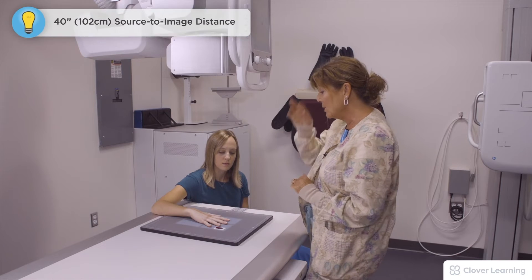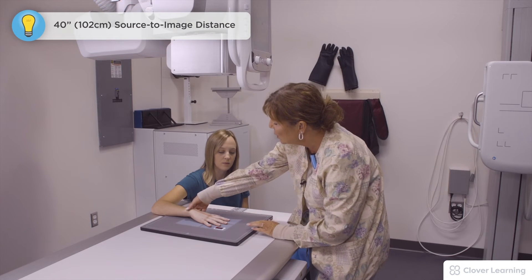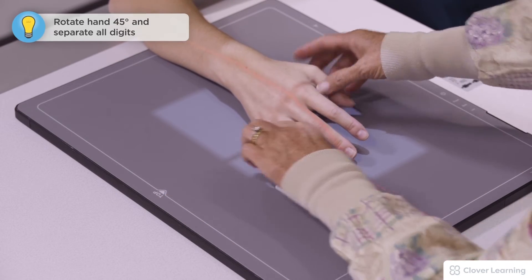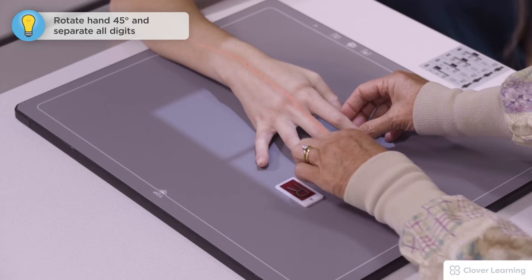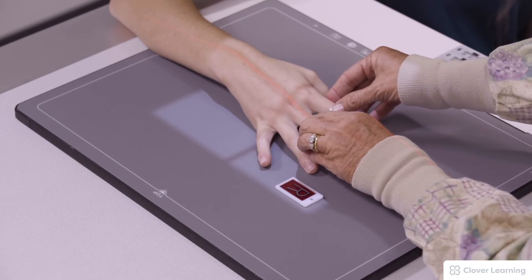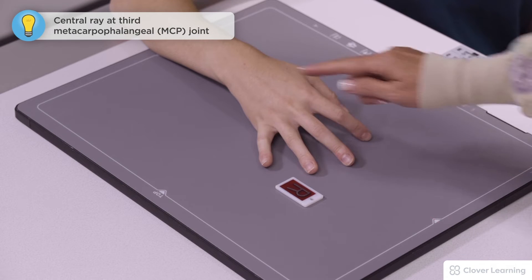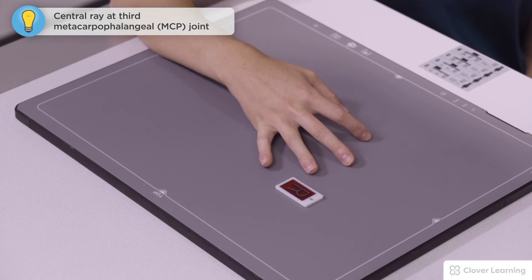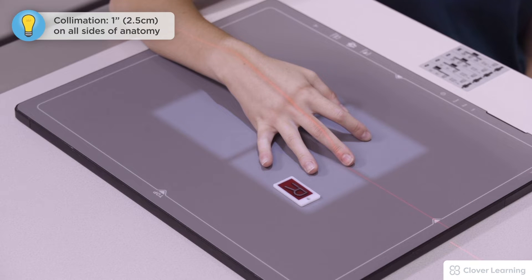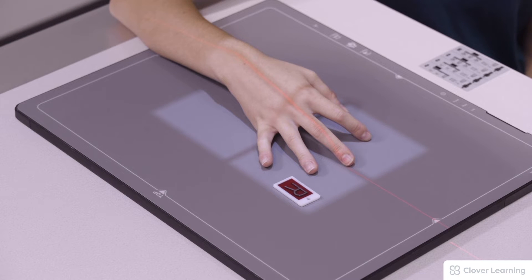Now we're going to come back in and do the oblique. We're just going to turn her wrist up about 45 degrees, placing each finger separated, still centered at the third MCP joint. All digits are within the light field, the marker is still there, and we're going to take that exposure.